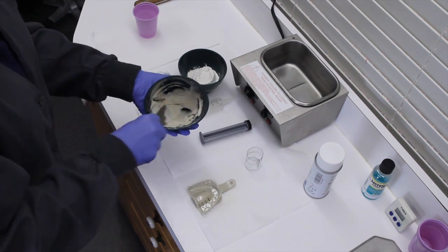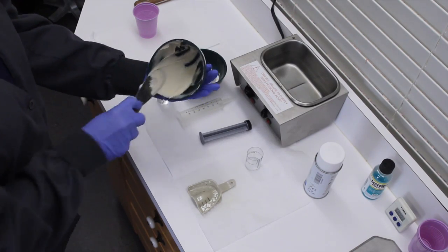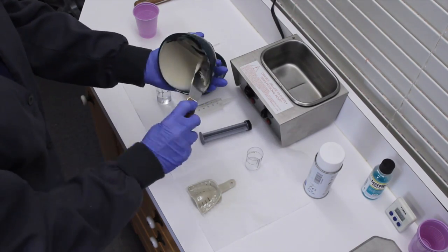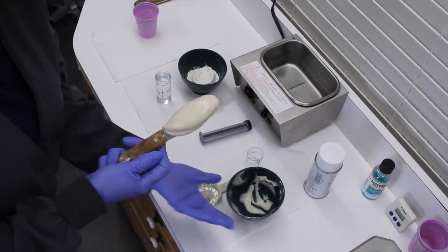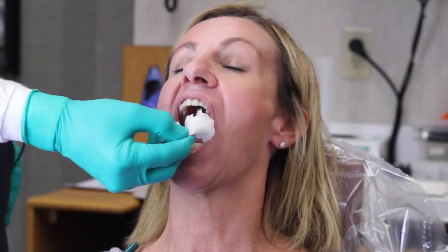Now, as I'm speaking, Donna's over there mixing the low viscosity material for the injection into the 35 milliliter syringe. And although we don't normally do this, for patients who are very, very wet, we actually do this more on the lower than the upper. We'll put a little bit of 2x2 gauze in there and just absorb, so we're not in a pool of water. So as I'm speaking, Donna's loading the syringe with the low viscosity alginate. When she's done, she's going to hand that to me.